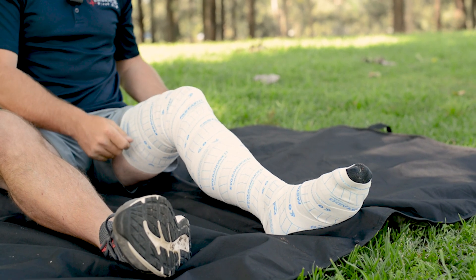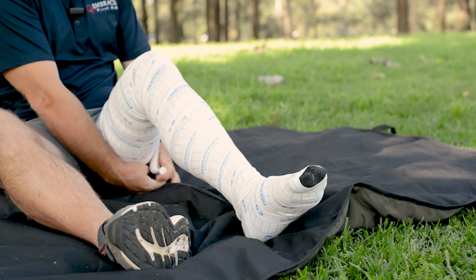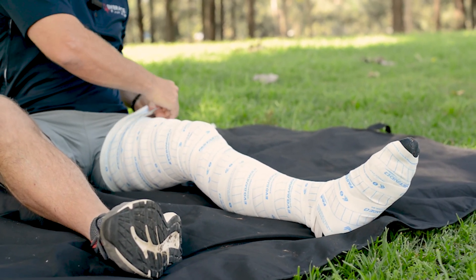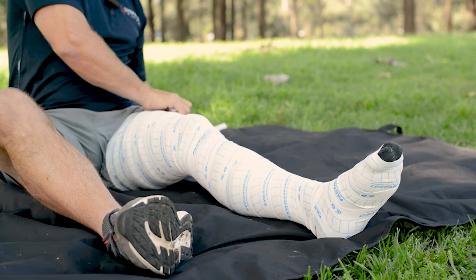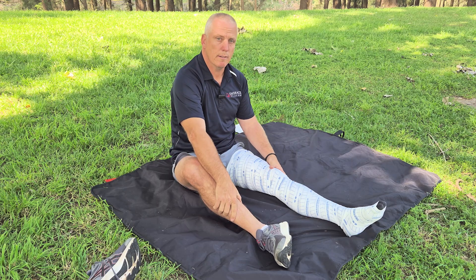Continue up to the lymphatic system and tuck it in. Then immobilise the limb, keep it nice and still, and call for help.